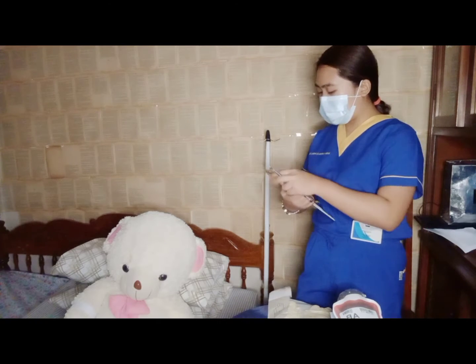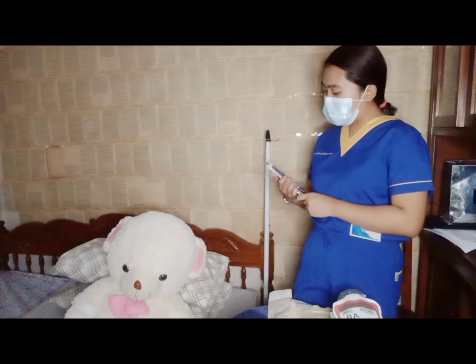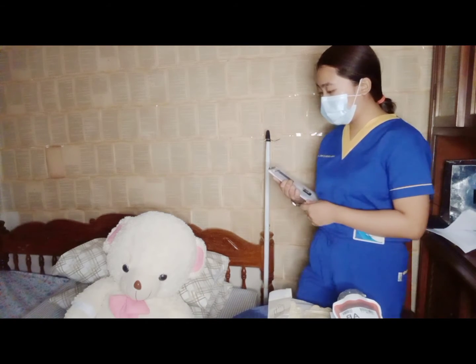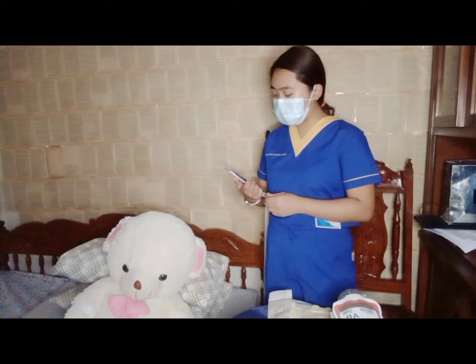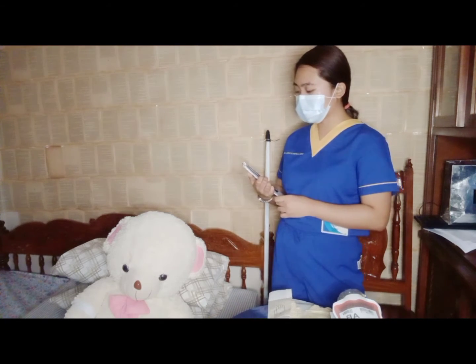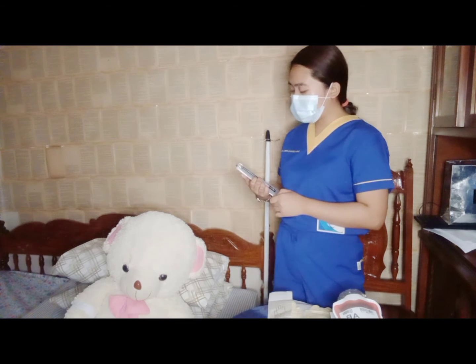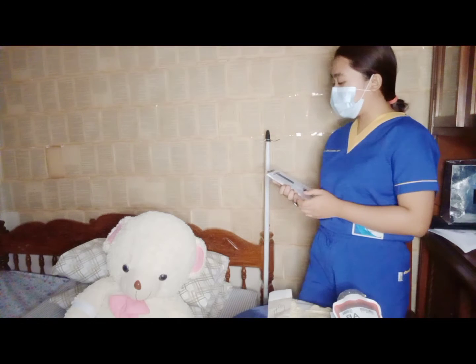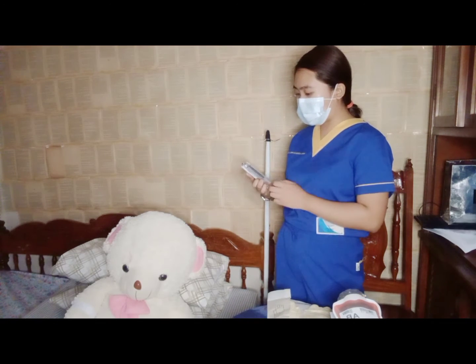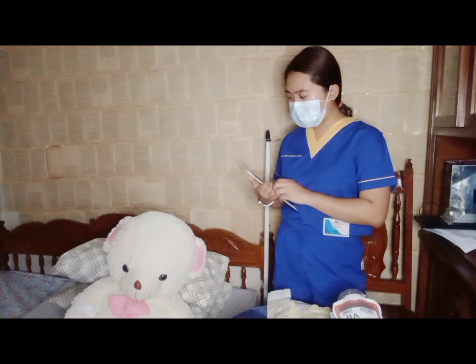Okay. So, in order po ng doctor ninyo na mag-undergo ka sa blood transfusion. So, sasalinan po kita ng dugo ngayon. Okay, so, nasubukan nyo po bang masalinan ng dugo noon? Okay, so, sasalinan po kita ng dugo. This is to restore yung blood loss ninyo. Okay po ba yun? Naintindihan niyo po ba, ma'am? May mga katanungan po ba kayo?